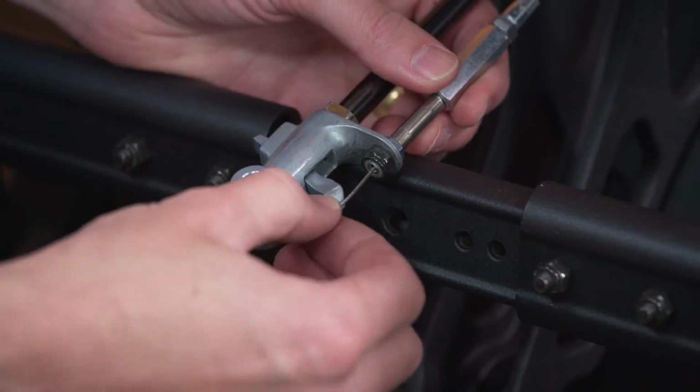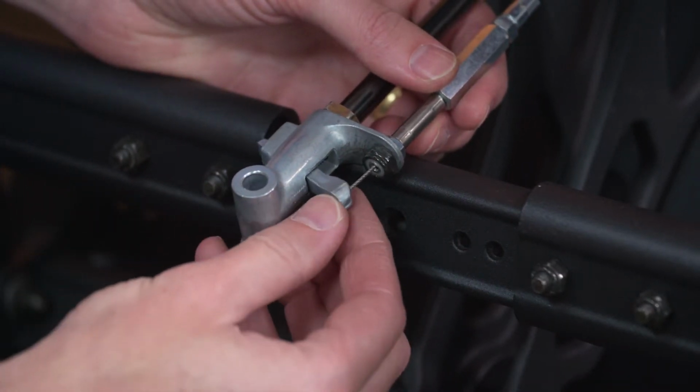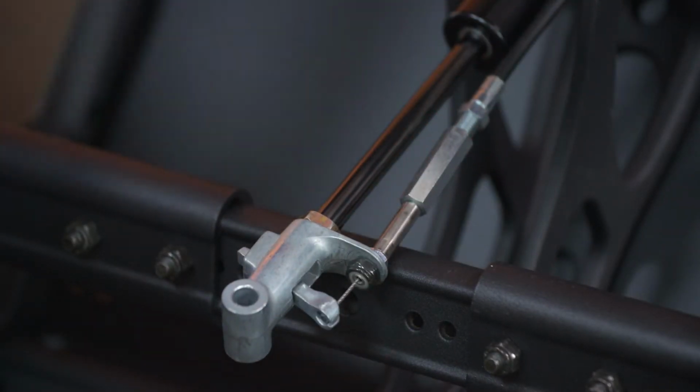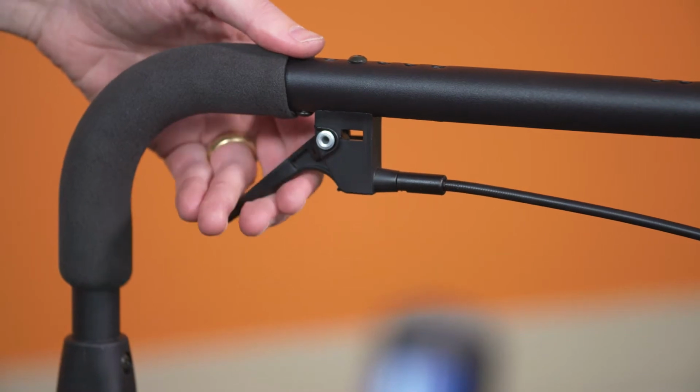Reinstall the cable end fitting. Lengthen the cable turnbuckle. Check to ensure the release lever is adjusted properly.